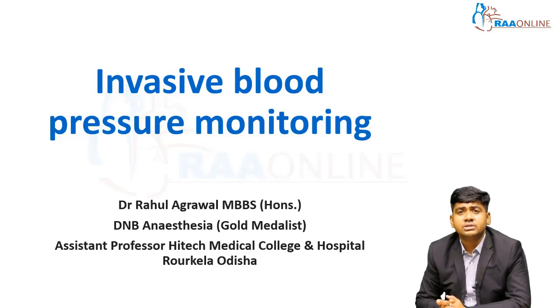Also, invasive blood pressure monitoring is used to help with fluid requirement or fluid measurement, to give intravenous fluid, and to know whether the patient is fluid responsive or not. In comparison to positive pressure ventilation, there are so many studies where we can see whether the patient requires fluid or not. There are also so many complications of putting an arterial cannula.